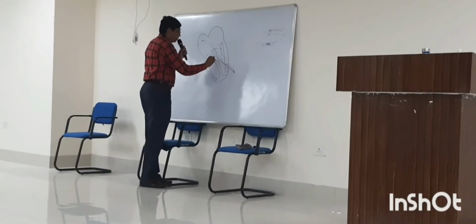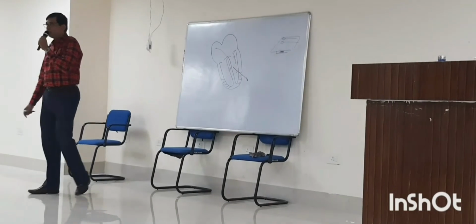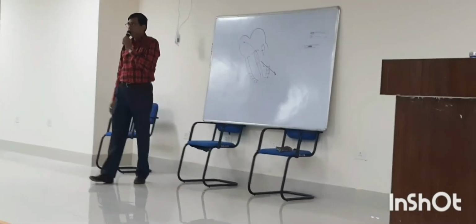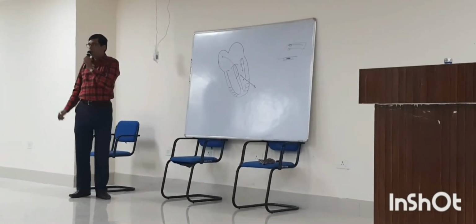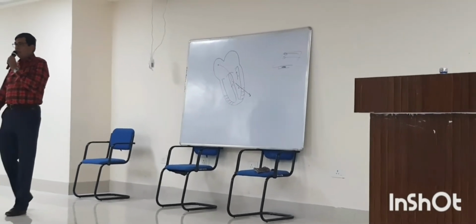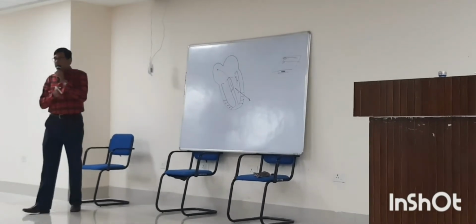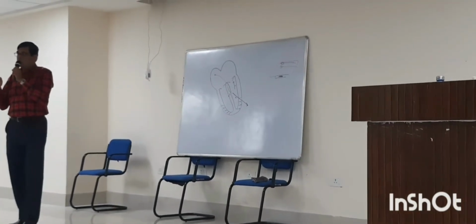So the first, second and third ventricular vectors. Some books say there is another vector from the apex of the interventricular septum to the apices. But for practical purposes, it is better to consider three ventricular depolarization vectors. Number 1, at the mid side of the interventricular septum, the direction is from left to right. Number 2, the large ventricular depolarization vector of the ventricular mass as a whole, which is directed from right to left. And then number 3, the depolarization of the basal regions, directed to the bases.